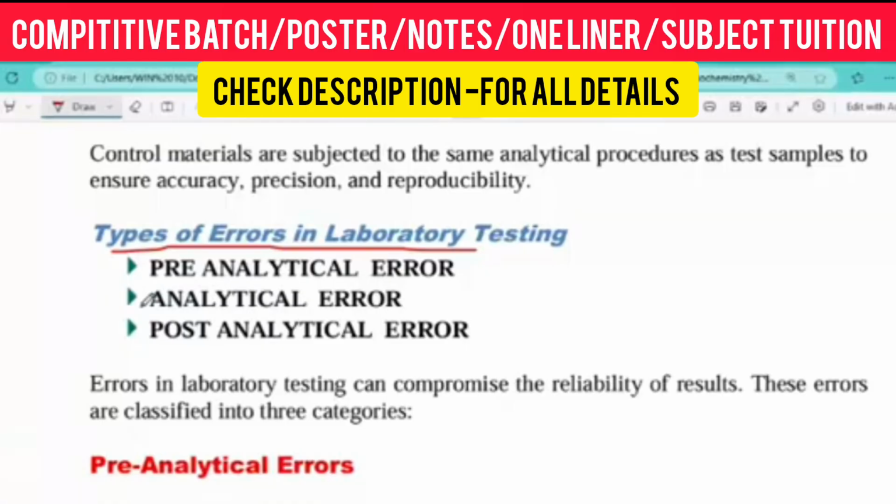Okay, see, first thing is the pre-analytical error. Firstly, our quality control motto is to identify the error and rectify the error. So the first thing is we need to identify the error. After that, we need to rectify these errors. Now we are understanding the methodology by which we can identify the error, and after that we will move to the rectification. Okay, and after that we will run the quality control. First we need to understand what kind of error might be happening in our clinical biochemistry laboratory.